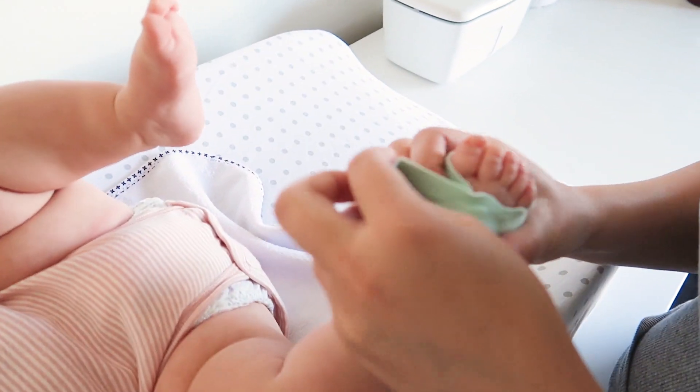Now moving into the cons: one of the biggest things is that you can get false alarms if the sock is not placed on correctly or is not the proper size. We've had that happen only once or twice — it is kind of scary but usually if you get an alarm it's a false alarm, and you just need to adjust the sock. If your alarm does go off, obviously go check on your baby to make sure they are breathing and okay, then just adjust the sock.